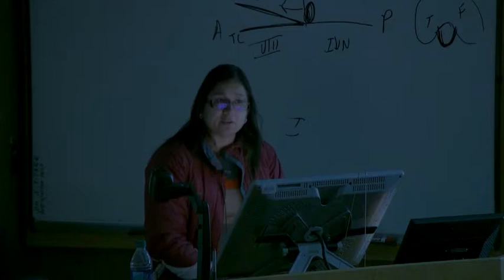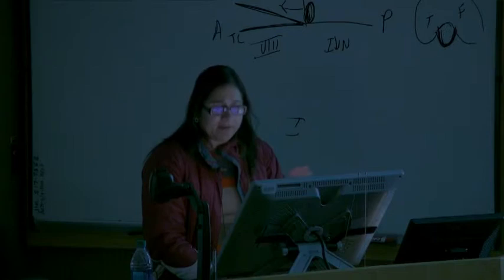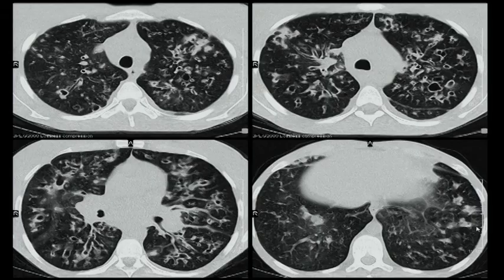Sinusitis, right? So I am going to give you the history that the sinuses were clear, and the patient demonstrates no sinus symptoms. All right, so we've identified bronchiectasis, hyperinflation, and some airspace opacities. So hyperinflation, bronchiectasis, and some branching opacities, which were mucoid impaction, right? This was all mucoid impaction right here, correct? Anybody want to give a diagnosis right now?